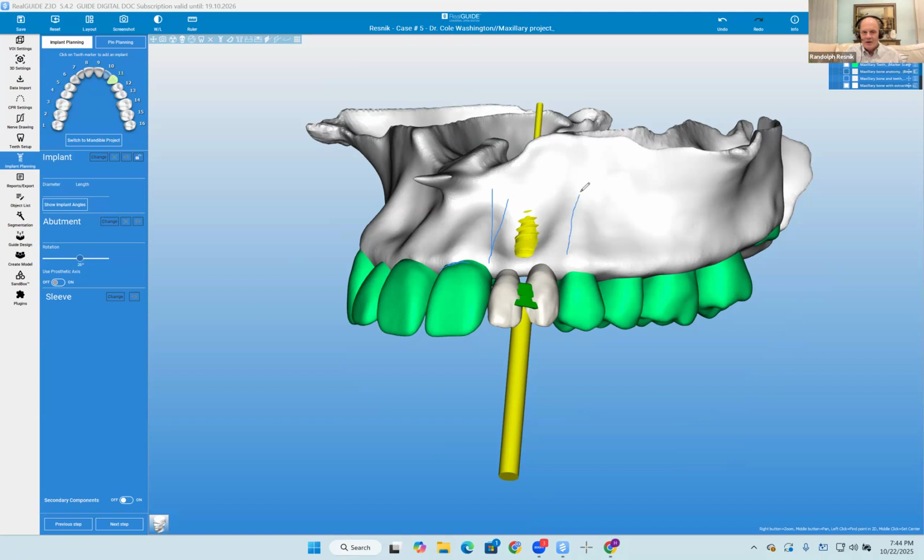Keep going. Now go 45-degree lateral. No, opposite. Distal. Okay, there you go. Now do another one on the other side. So Cole, what you want to do, go up to the mucogingival junction, 45 it, and really extend that release, and you'll be able to bring all that tissue over, no problem. Easy, simple.